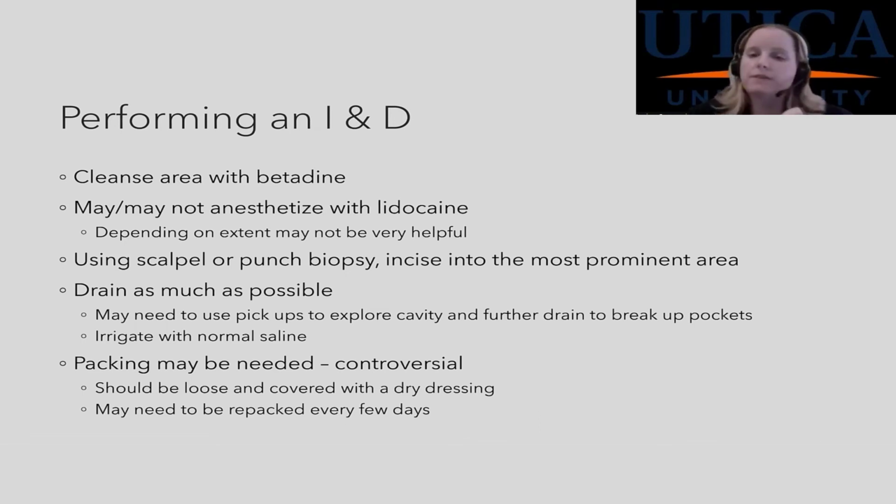Sometimes it just drains out nicely, but sometimes it does not. You want to drain as much as possible. Sometimes you need to explore the cavity, and at that point you may want to use lidocaine because that hurts a lot, if you're going to break up the pockets. Irrigate it with normal saline.